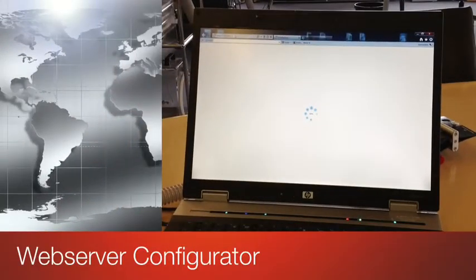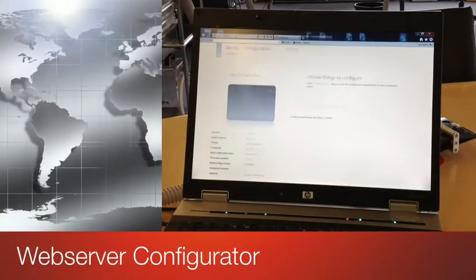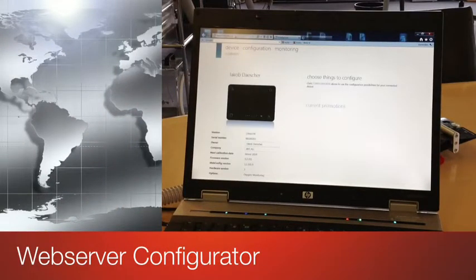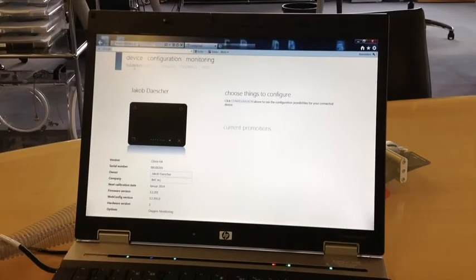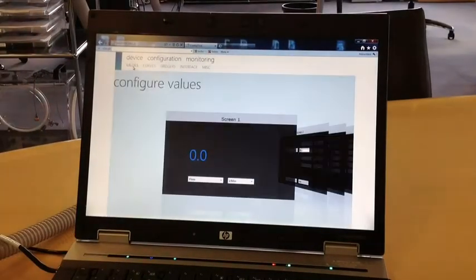Launch the embedded web server from a web browser. Then enter your name and company for your Citrex device.